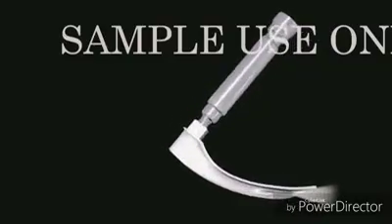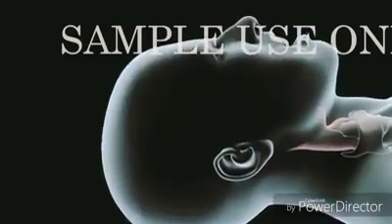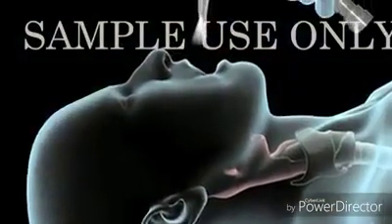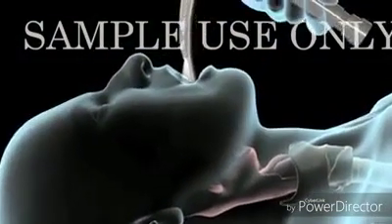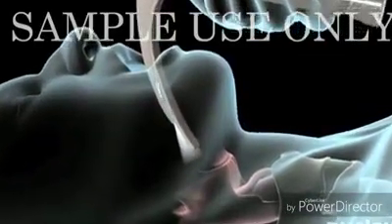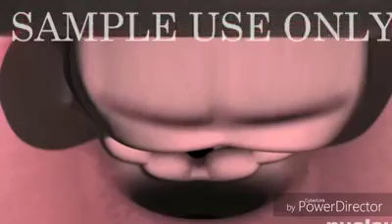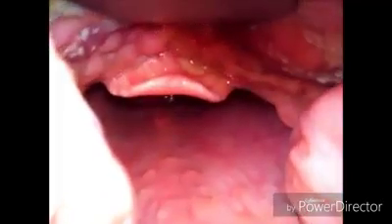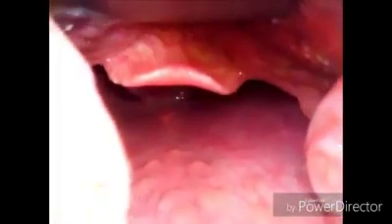Now to perform the process of intubation, slightly extend the neck of the patient. Now we are going to introduce the laryngoscope. Gradually introduce the laryngoscope, and as soon as you introduce the laryngoscope, you can see the uvula, tonsil and the epiglottis which is covering the trachea. You are supposed to introduce the blade just behind the epiglottis and lift it.